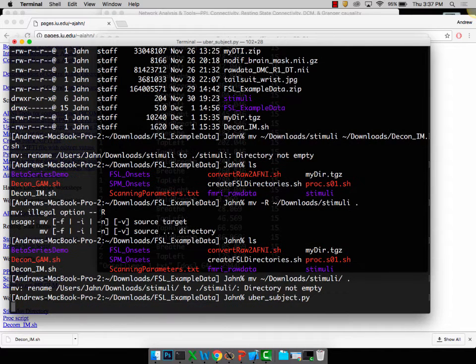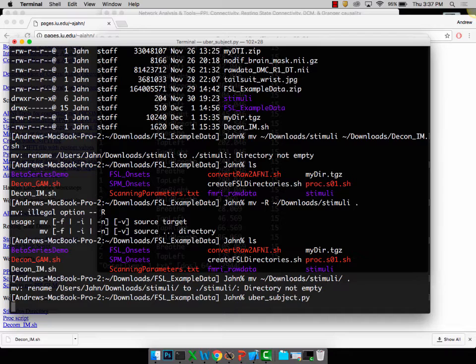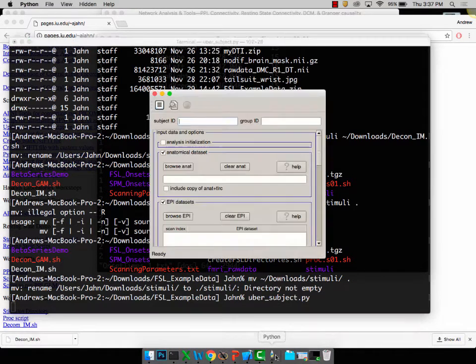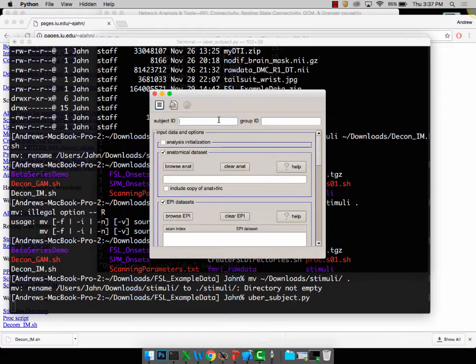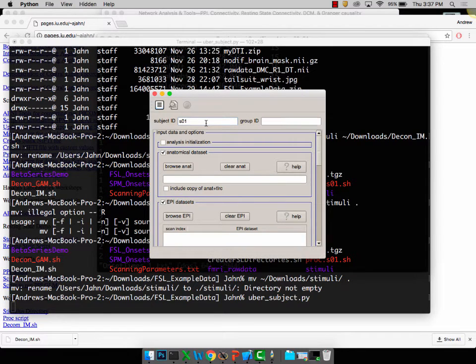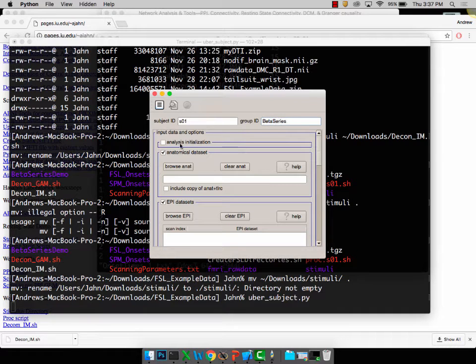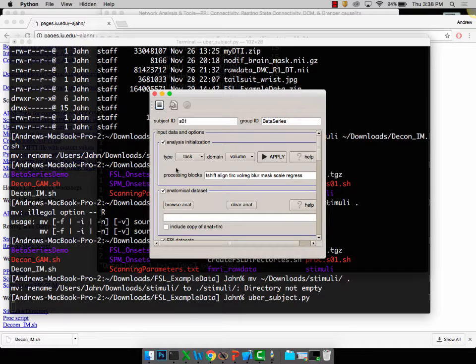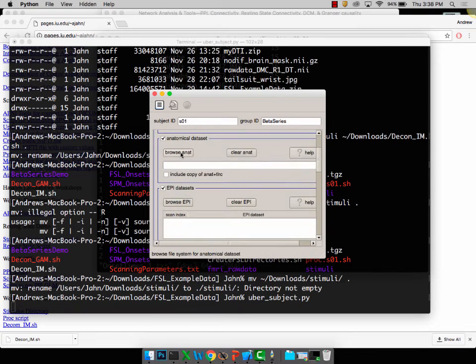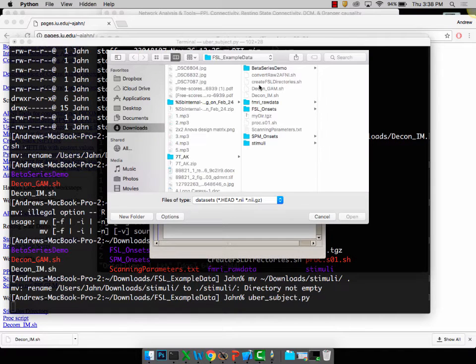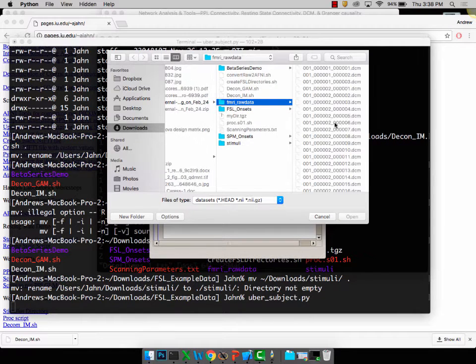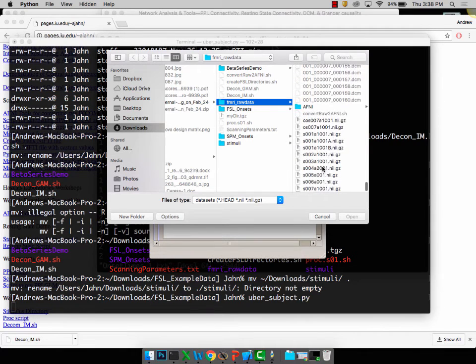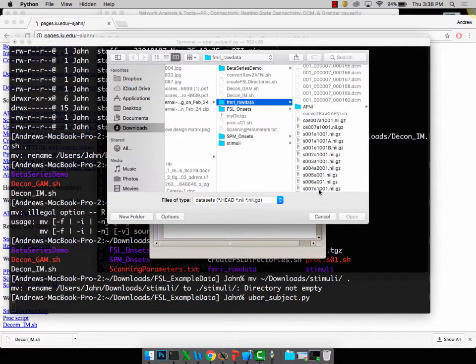This little rocket ship will open up. Subject ID, I'll just call this SO1, and group ID we'll call this beta series. This is what it'll call the different folders. Initialization, that's fine, you don't need to change any of the defaults. Anatomical data set is going to be within fMRI raw data, and within here we have all the DICOM files and also these were converted into NIFTY format. So the anatomical is S007A1001.